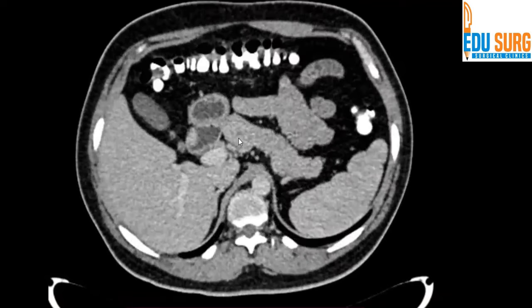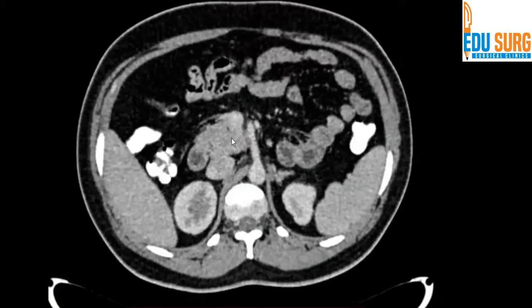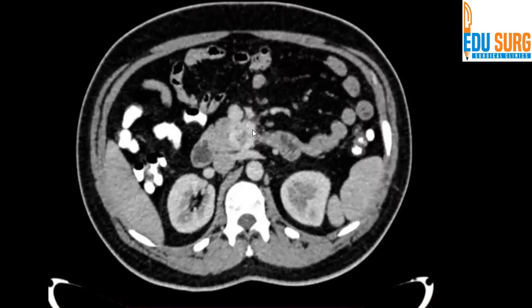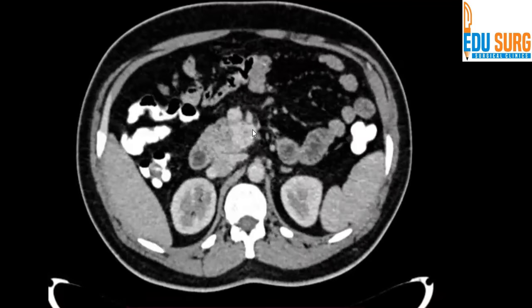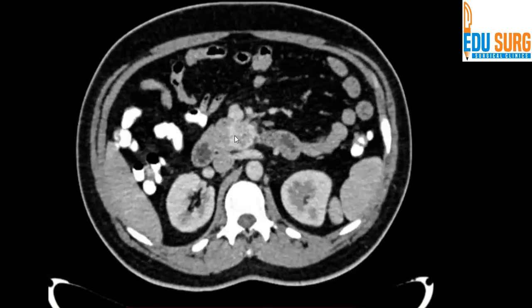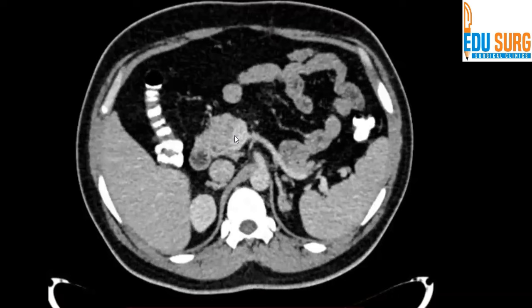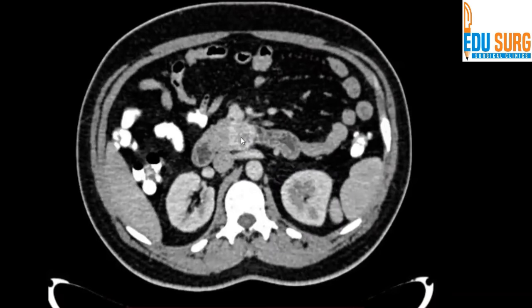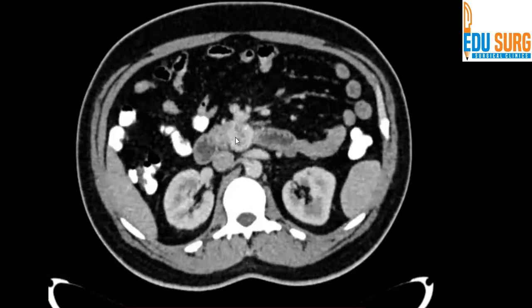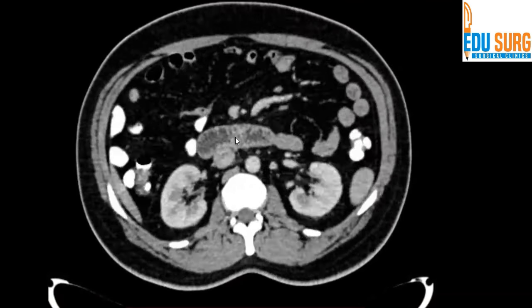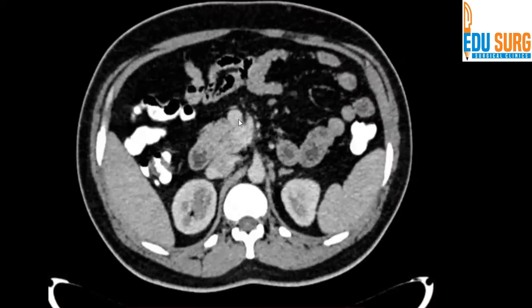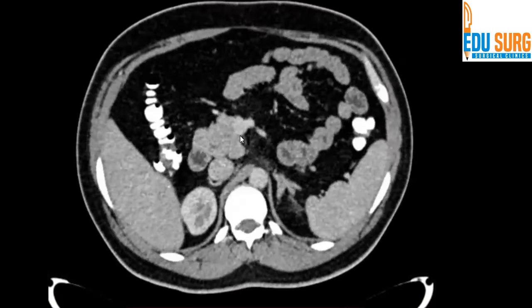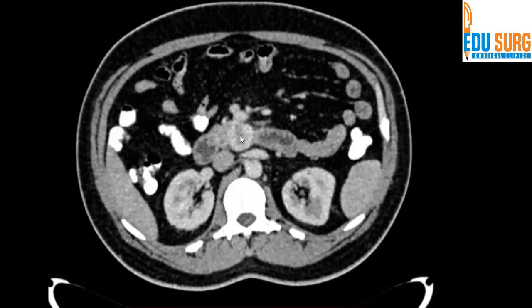This scan is very important because it was initially reported as an uncinate mass. Now if you label this as an uncinate mass, the differentials are only two: an uncinate neuroendocrine neoplasm, or a metastasis to the pancreatic uncinate process — and hypervascular metastasis to the pancreas are usually from kidney. This patient had no history of RCC. So this hyperenhancing or hypervascular lesion could be an uncinate neuroendocrine neoplasm — lighting like a light bulb — or it is a lymph node.